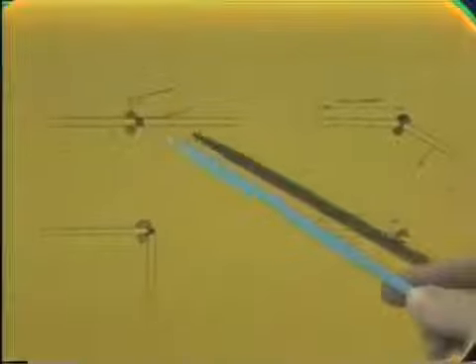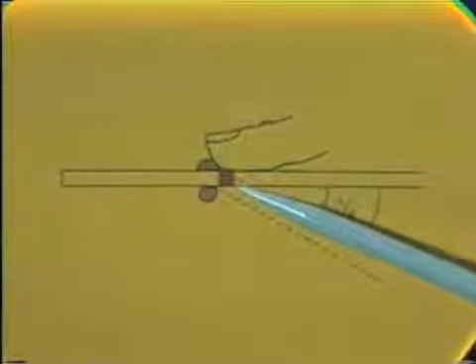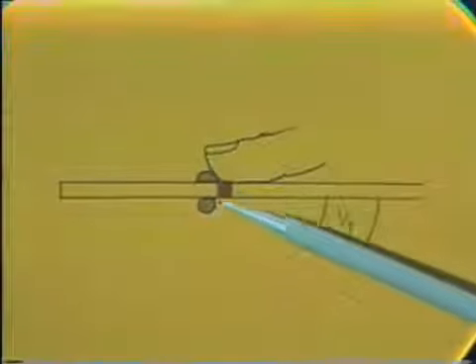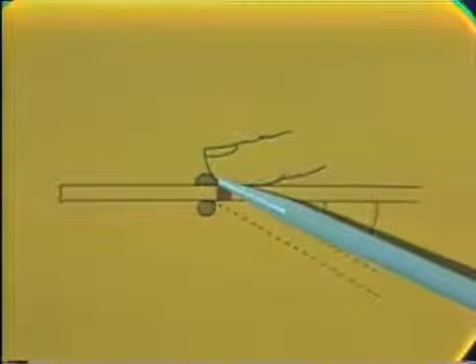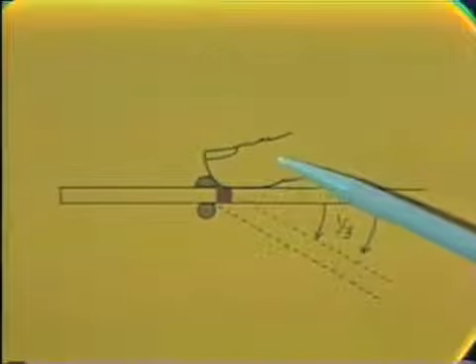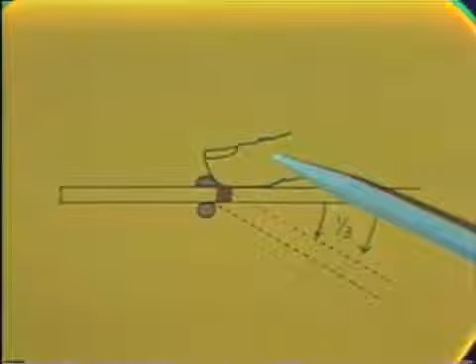This chart illustrates the right angle bend procedure. A mark is made directly over the corner of the wire on the pattern. The beaks of the plier, represented here, the round beak and the flat beak, are placed on the side of the mark. The thumb is placed as close to the beaks as possible, and pressure is applied so that the bend is made 1/3 of the way.